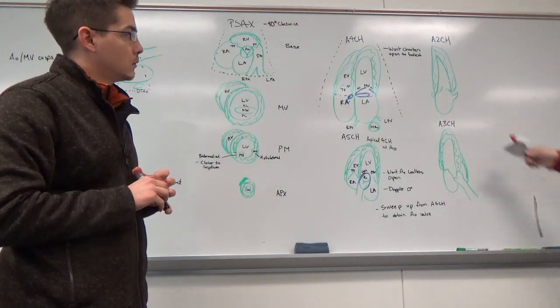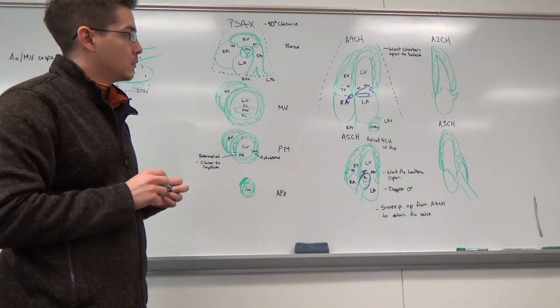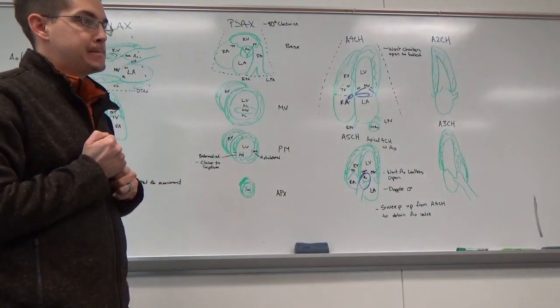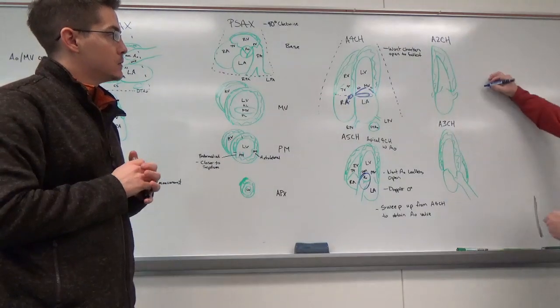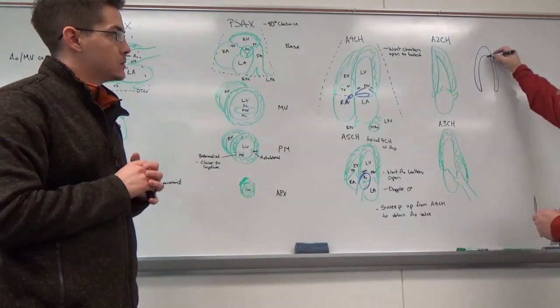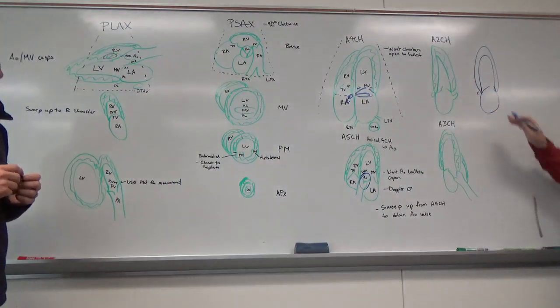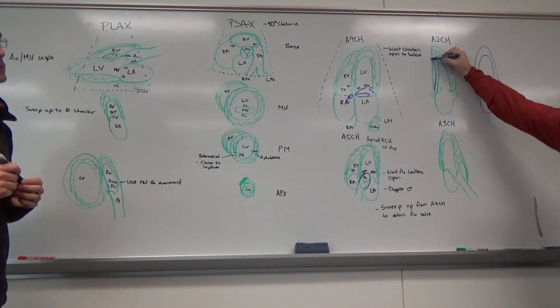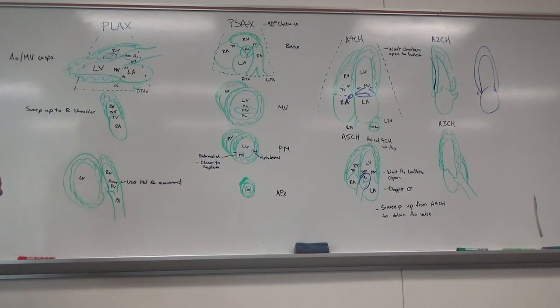Why did I draw the 2-chamber this way, do you think? Because that's how it is. So it's not perfectly like that. When I turn on a two-chamber, one of the ways you can know you have a good two-chamber is this: a lot of people will get a two-chamber that looks centrally located with the valve in here. But if you don't look like this, it actually bows this way. That wall, the inferior wall, is anatomically what the heart actually looks like.